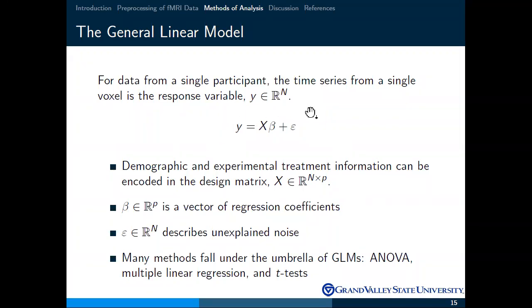There are issues of the data being temporally related across time. That should be accounted for in this modeling process. So you could use generalized least squares, in which you account for the time series aspect of the data, although that has limitations: in order to use GLS, you need to correctly specify a structure on the error term, and that makes assumptions that might not necessarily be true.